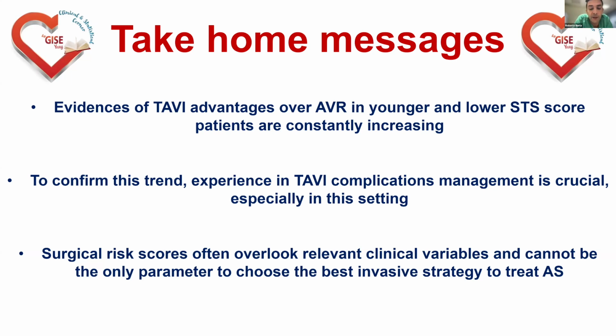Well, it's not easy to answer. I think it's probably a combination, because you always look for the proper device for that kind of anatomy. What we know today is that bicuspid valves are not the same. We have different types of bicuspid, and it's not just the Sievers classification, type 0 and type 1.